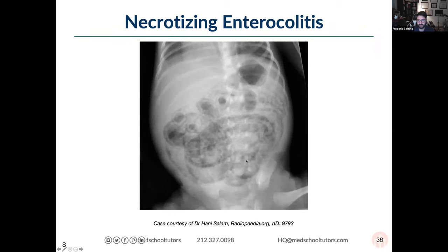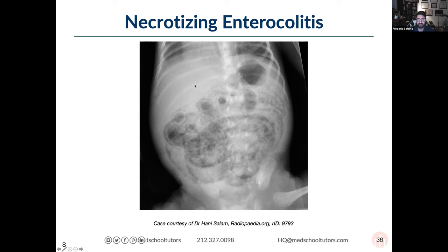Portal venous gas is another ominous sign of dead bowel or bacterial translocation — the air produced in the bowel has to go somewhere, and the bowel drains blood to the liver via the portal vein. Portal venous gas should raise suspicion for very dead bowel or bacterial translocation, which can be a very bad sign for infection.